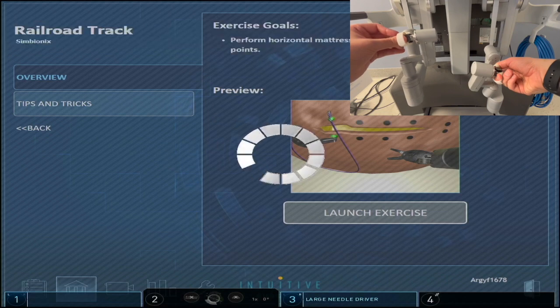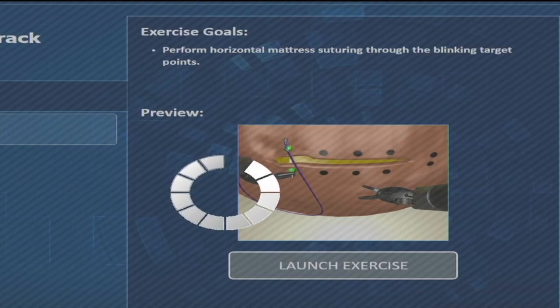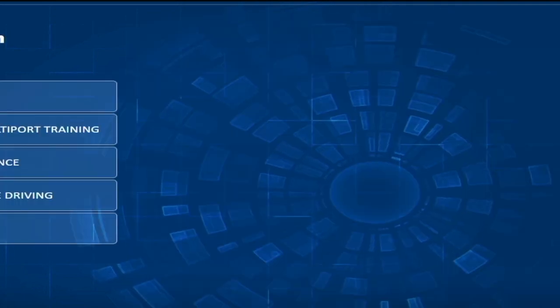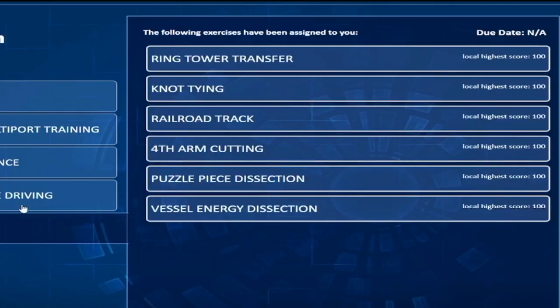That's about it. That's how you get either 99 or 100 on the exercise.